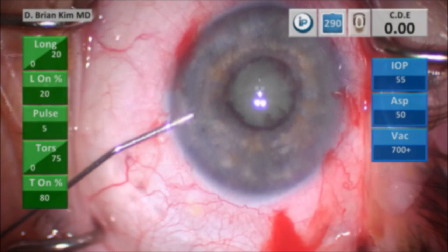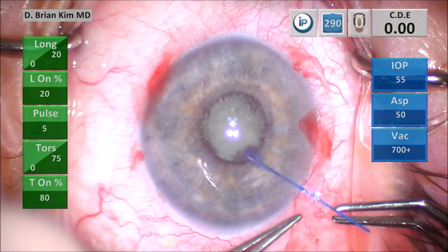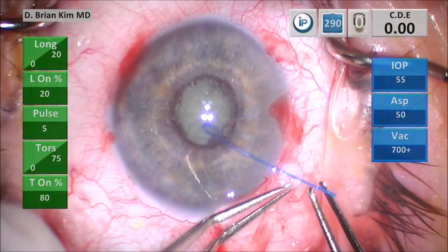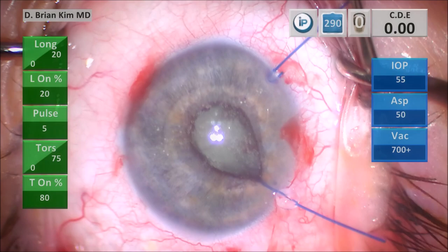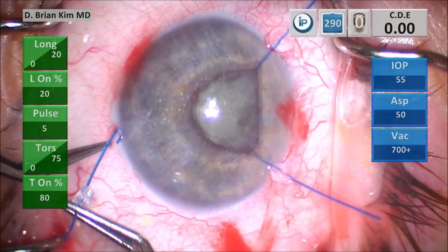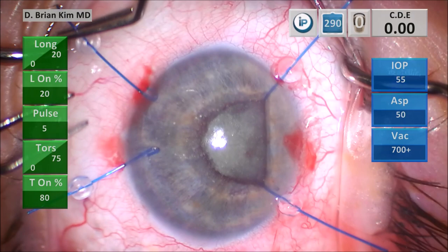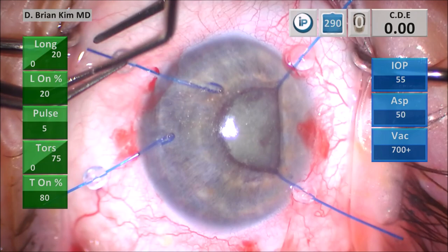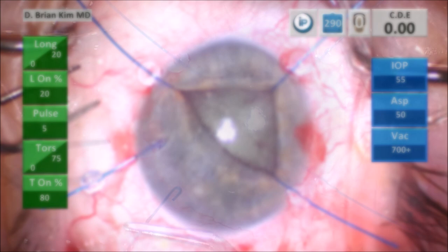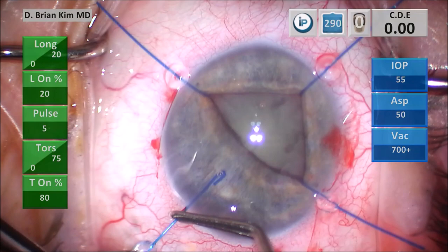I like these blue iris hooks — I believe they're through FCI. As you put one in, you want to twirl the stopper so it's pointing downward, then engage the pupillary edge and pull the stopper back. This requires a two-handed technique. It helps to put the iris hooks in the area where the hook has already been lifted, because each hook lifts the iris a little bit — so go after the hook adjacent to where you placed your other hook. I moved that hook and placed it in a different position.